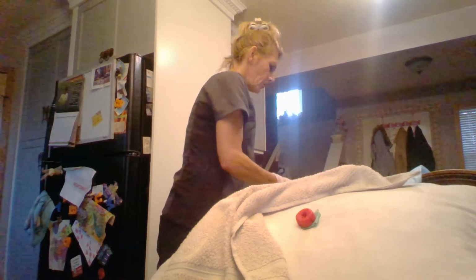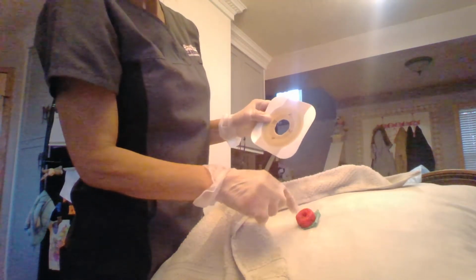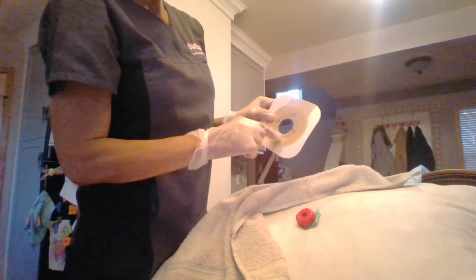So you measured your system. You've used any adhesive remover to remove it. You've cleaned your stoma. You have your barrier cream. Make sure that you check the expiry dates, and that it's the right cream for the right client, and make sure that both your adhesive and your barrier cream are right. Now, the barrier cream would go on the back. Some people like to put it around the stoma, but you'd put it a little bit around the back.